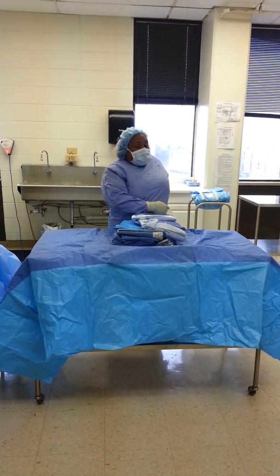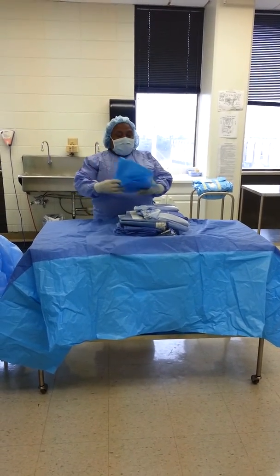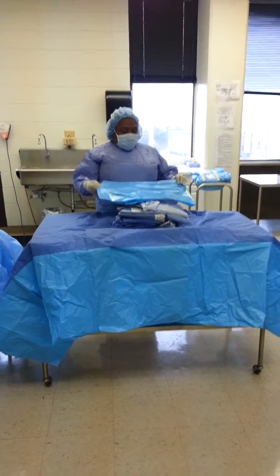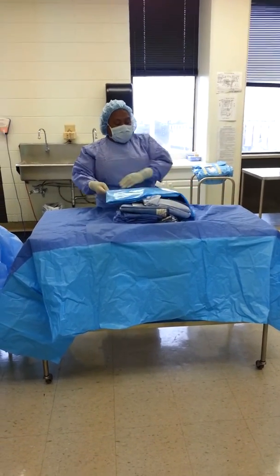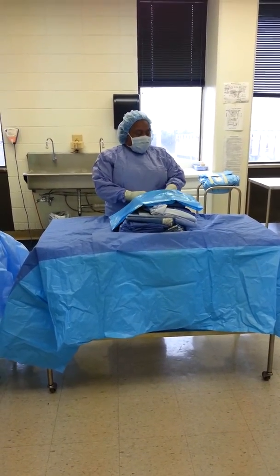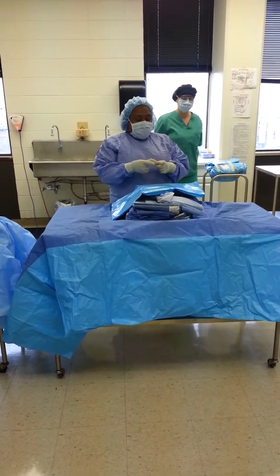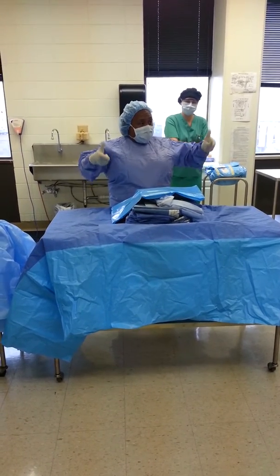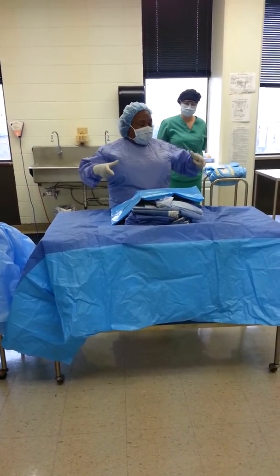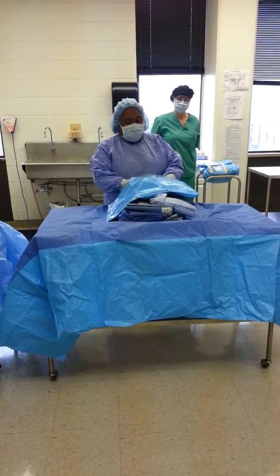Okay, so the next thing, in your chapter, talk about extending your sterile field. So that's where the mayo covers come in. It tells you left hand, right hand. And I have some extras on the bed for you to work with. You put your hands under the cuff, and you remember that little football game, but your fingers are going to hold the contents of the mayo cover so it doesn't drop. The other two fingers are like this, they're open to go over the stand.